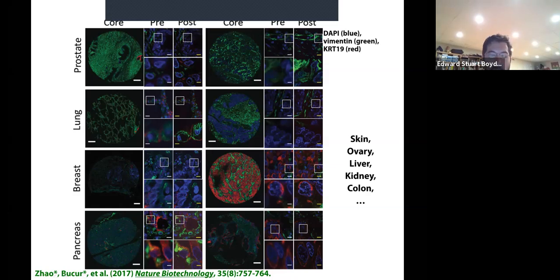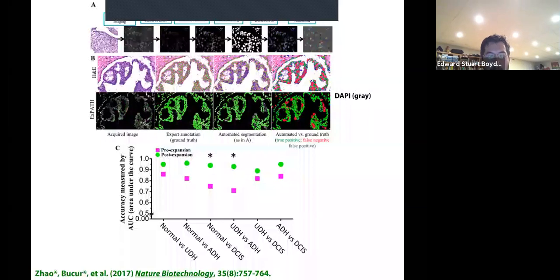Using this strategy, we could try to detect cancer earlier than before. A team of pathologists would grade breast cancer biopsies before expansion and after expansion. They used these votes to train a simple artificial intelligence. And the training done with post-expansion data, shown as green circles, was much more accurate than if the training was done on pre-expansion data, shown as magenta squares.